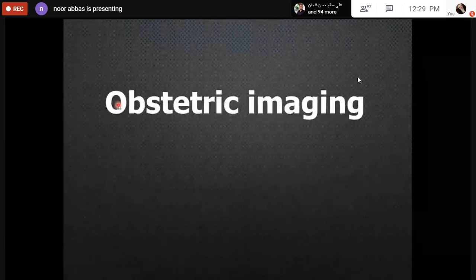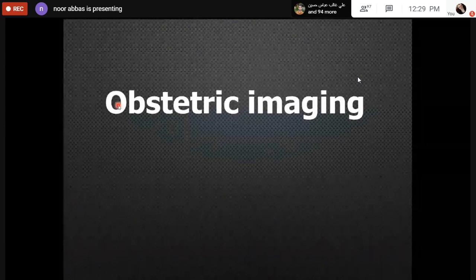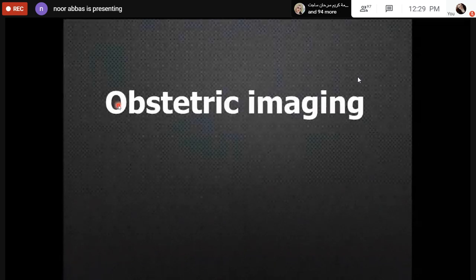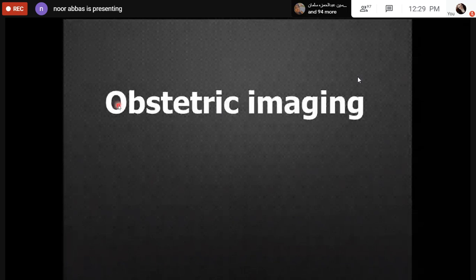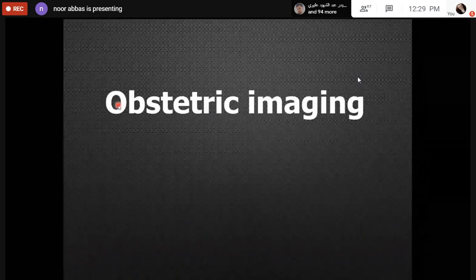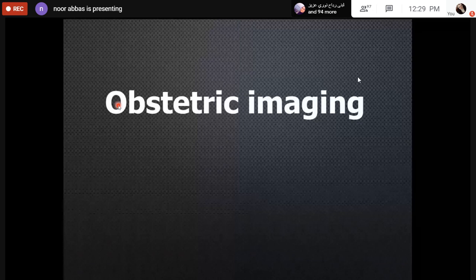General idea about gynecological malignancies, we have the role of imaging modalities. فبالنسبه لليوترس والسيرفكس it is used for staging, okay, local staging. وعرفنا انه شلون الهستروسكوبنجوغرافي والمين انديكيشن main indication of hysterosalpingography. طبعا هذا البروسيجر performed by insertion of cannula into the cervix and injection of iodinated contrast medium and then filming fluoroscopy. Fluoroscopy يعني movie, X-ray movie to show the progress of contrast through the tube.